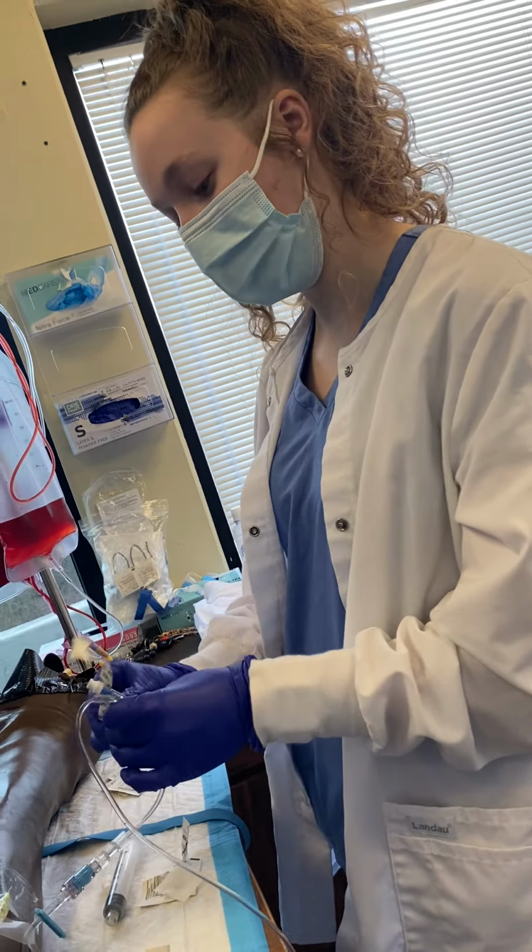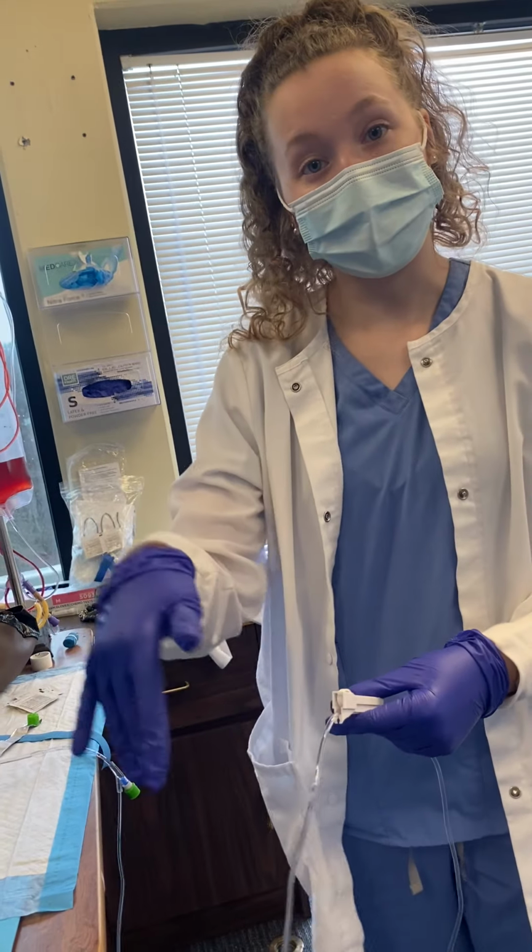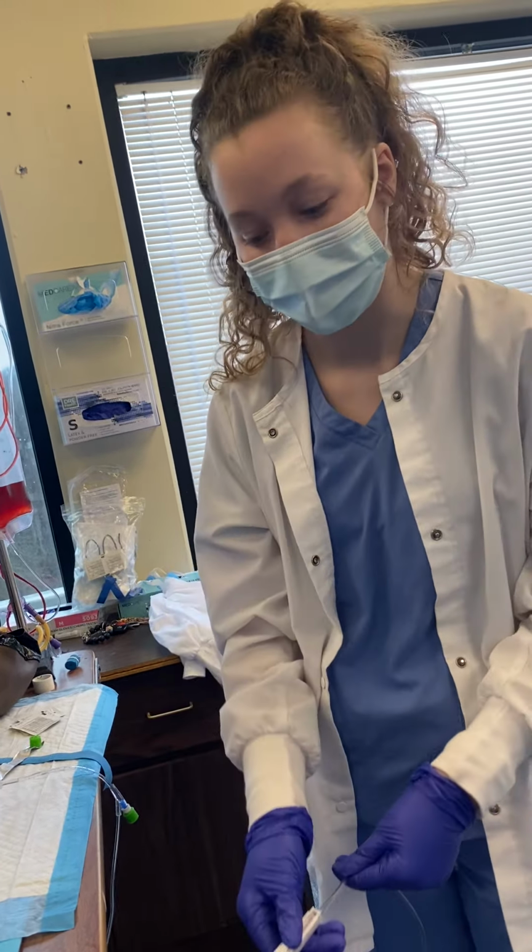I'm going to clean up my area, and then I'm going to ask the patient how they feel. I'm going to make sure that they haven't had any adverse reactions from that medication. I'm going to document the time that I gave the medication, what it was, the rate that I gave it, and that they had no reaction from it. I'm also going to document that the IV site looked good and there wasn't any infiltration or inflammation or any other complications. And then I'm just going to unclamp my primary tubing that was running beforehand, or I would restart the pump if it was running through a pump.